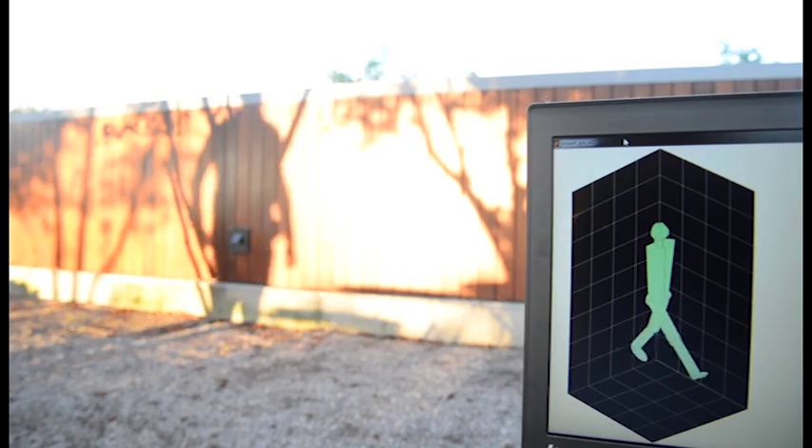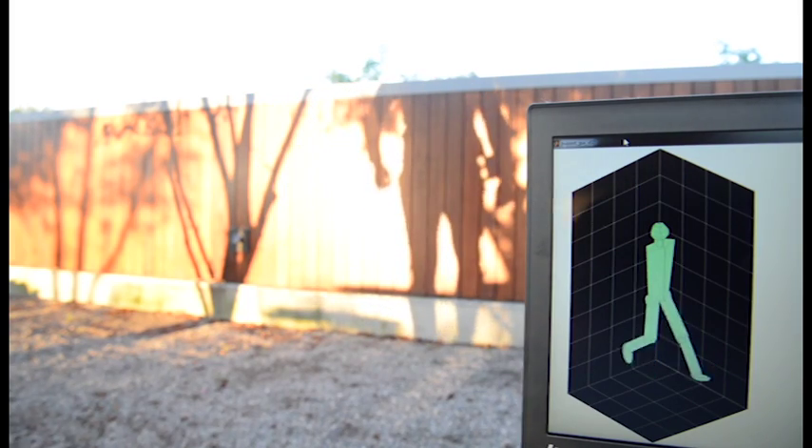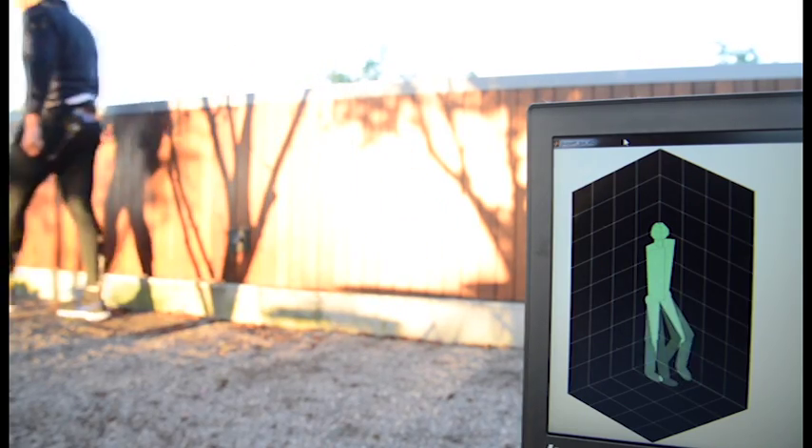The soft sensor suit holds promise as part of soft wearable robots for assisting locomotion, as well as motion capture systems for athletic training, medical diagnostics, and consumer electronics.